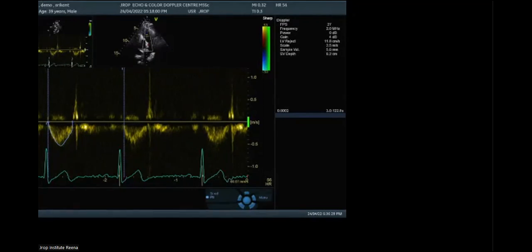I have some queries, sir. First of all, can you show me, sir, the ductal view? Oh, you're doing a pediatric echo.